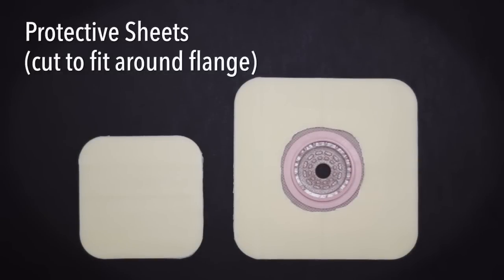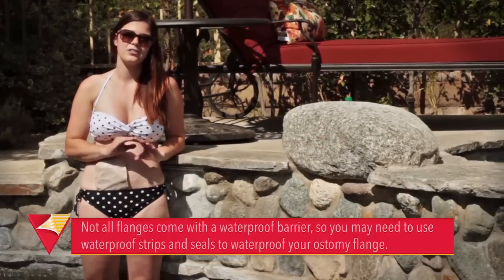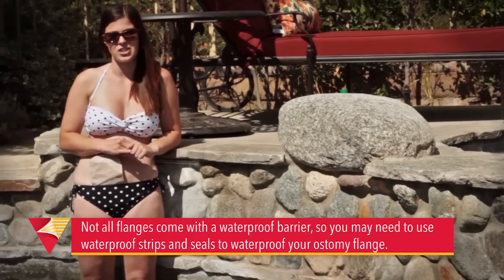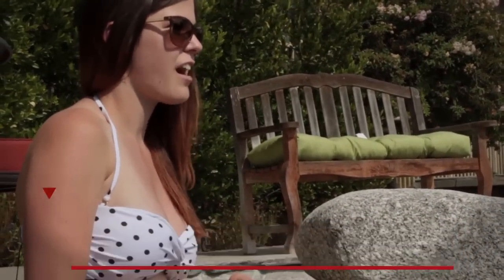It's really important to note that you should take these off right after swimming so that your skin does not react poorly to it and you do not develop a yeast infection. If your flange already has a waterproof barrier attached to it, there's no need to change that.